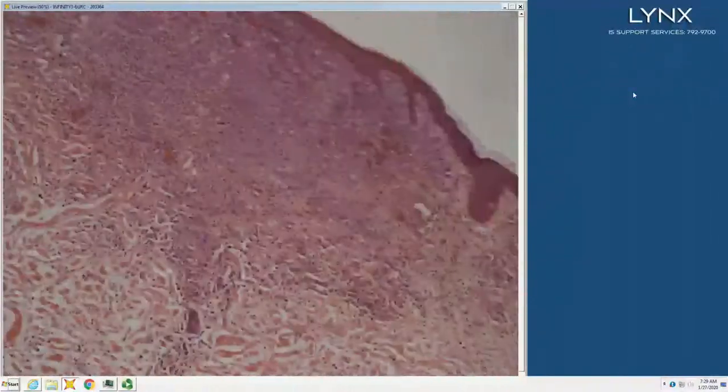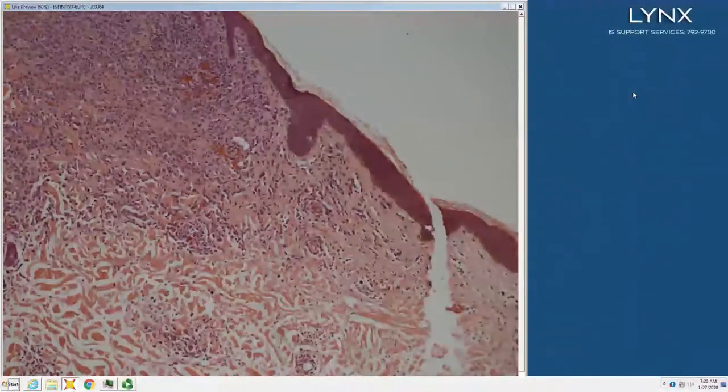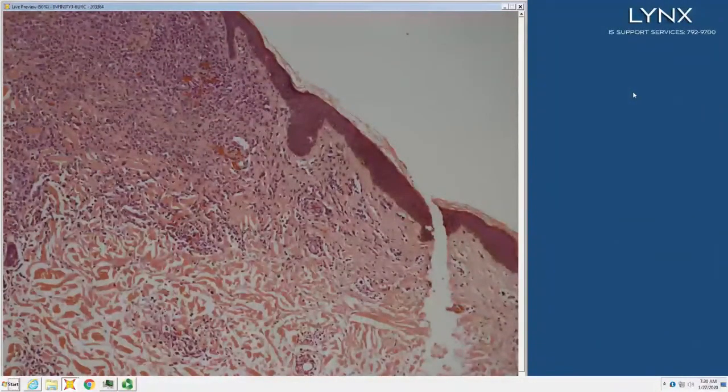Here we've got something that you can see. First off, papillodermal fibrosis, and you have lymphocytes in tiny little vacuoles between that ropey collagen. So it sits like a lump of coal on a pillow between dense ropey collagen. That's virtually always a T-cell lymphoma pattern.